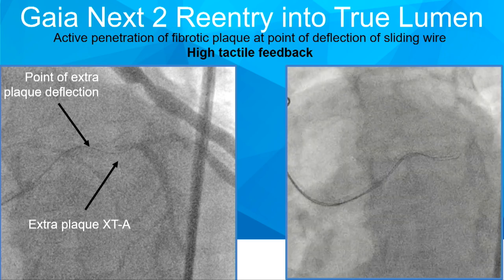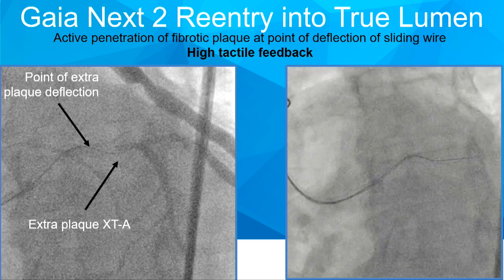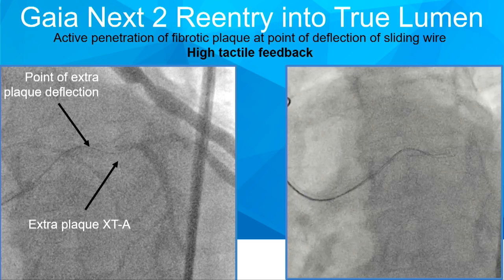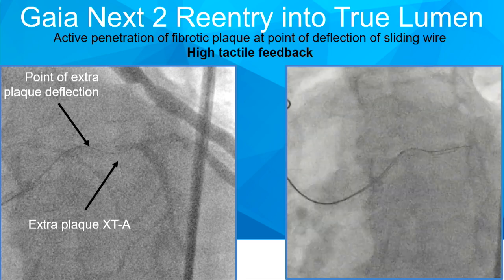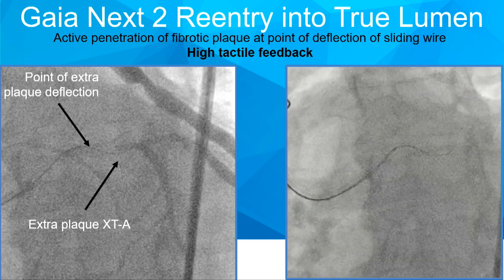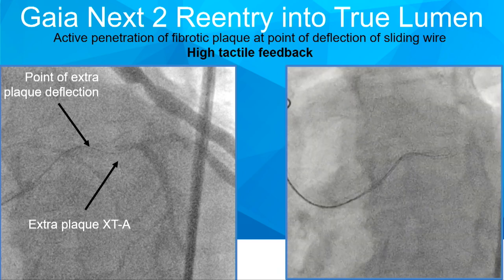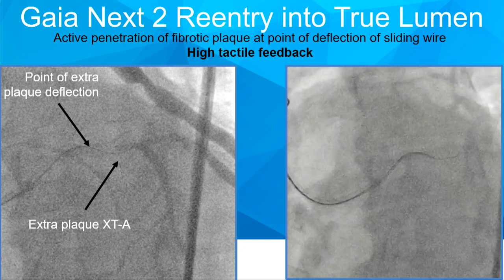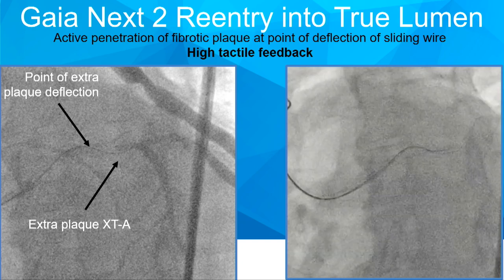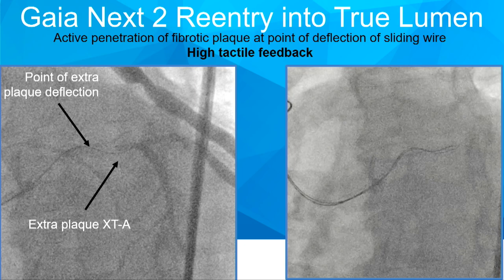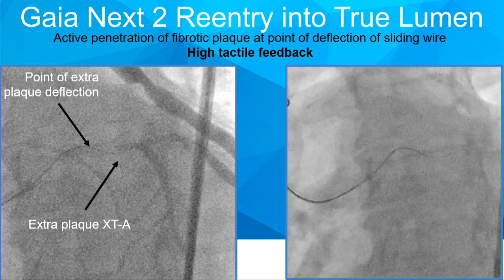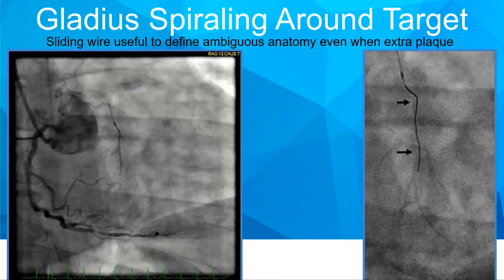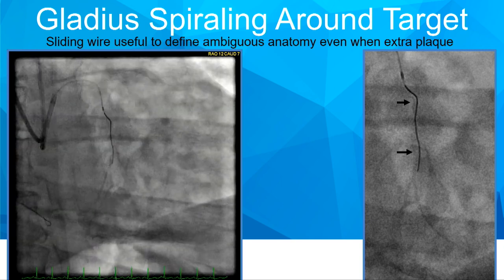This is an example of a left main CTO where the soft jacketed wire very quickly became extraplaque — deflected off course — and people might panic here, but this is not a problem. You've now identified the course of the left main. Then take a steerable wire and drive it away from where you've deflected off course. Using the GAIA series wire to on purpose drive away from where we felt we veered, we very quickly re-entered the true lumen distally — using high tactile feedback to correct the problem of the deflected soft wire.